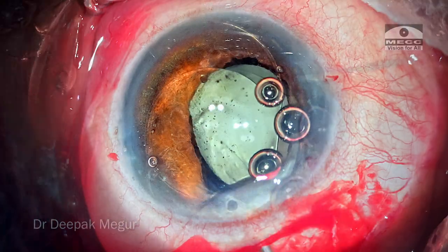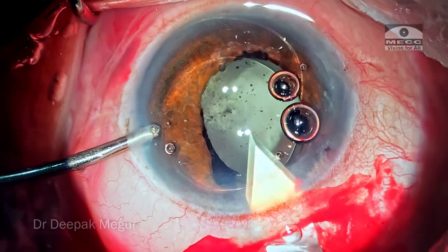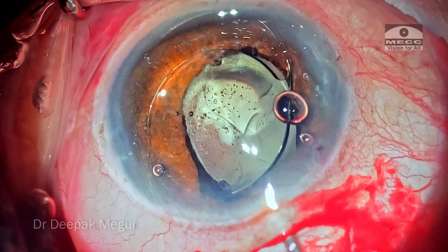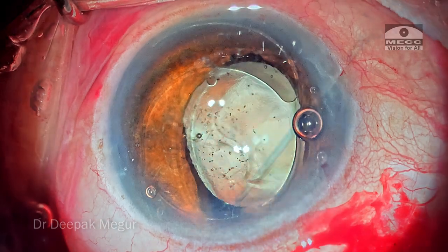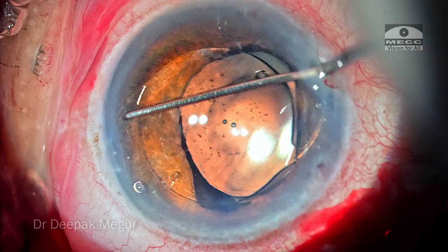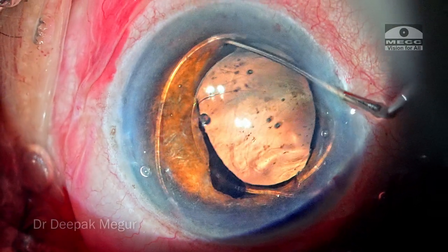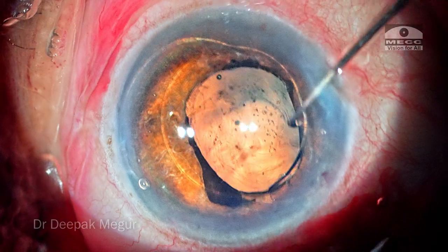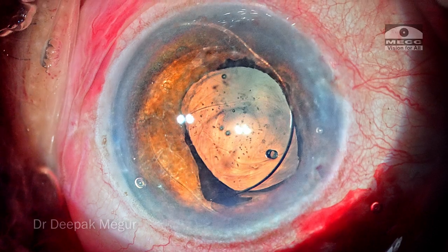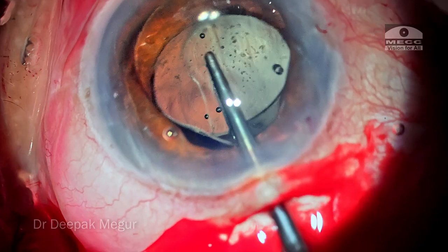The chamber is filled with OVD. I'm entering the main scleral tunnel incision with a 2.8 keratome and the inner corneal lip of the sclero-corneal tunnel incision is enlarged. OVD is injected in front of the lens and behind the lens. I'm using a Sinskey hook to dial the lens around a little bit, just to ensure that it is freely mobile and not entangled in iris tissue or inflammatory membrane. The haptics are oriented in such a way that it's easy to negotiate the lens out. Then using a Daljeet lens holding forceps, the lens is grasped and pulled out of the eye.